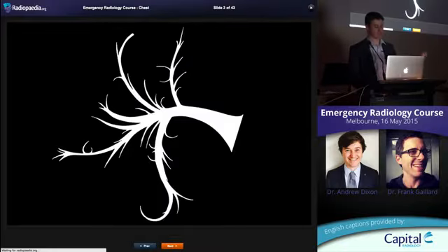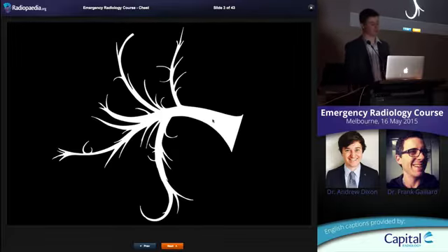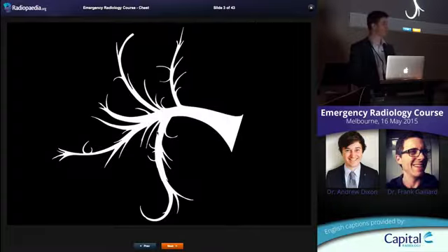So just to emphasize that, here's the black. The black is the lung, and this is my attempt at drawing, it's really a tree, the blood vessels moving through the lung. As I said, you should be able to trace them very, very easily on a normal chest radiograph.